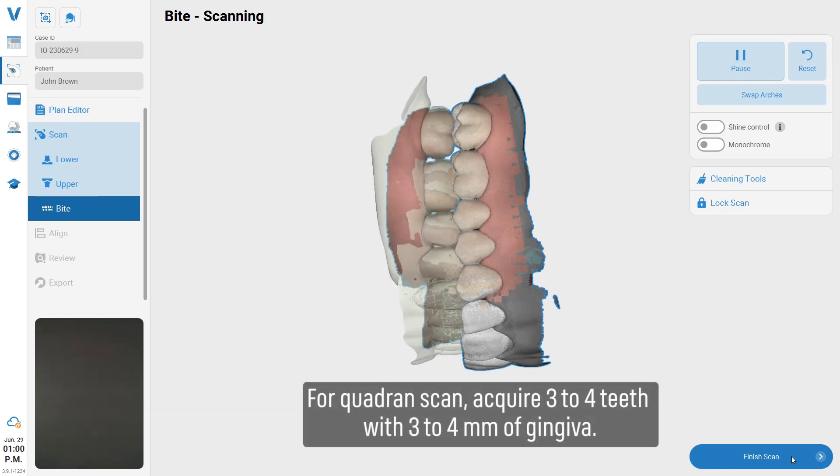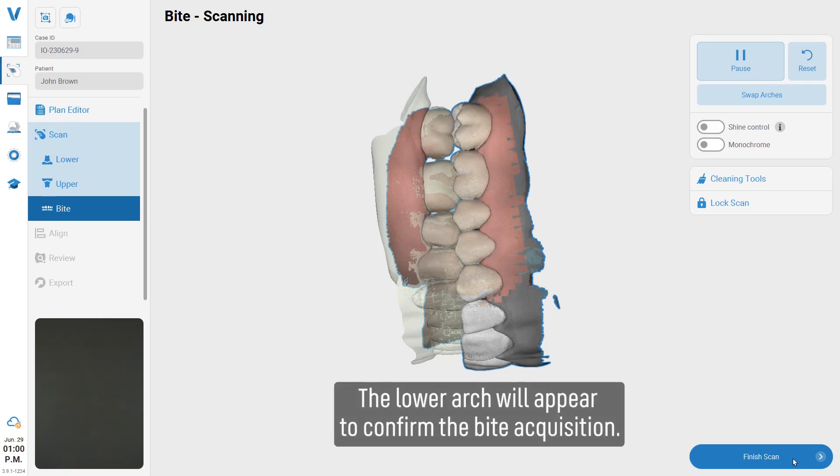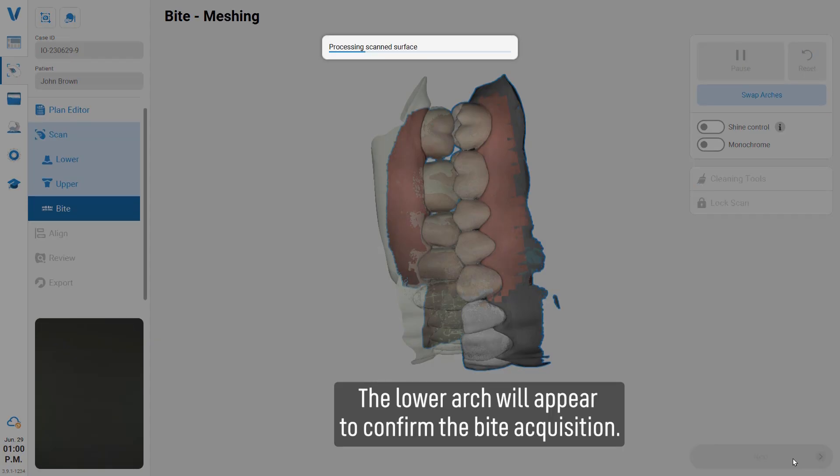For a quadrant scan, acquire three to four teeth with three to four millimeters of gingiva. The lower arch will appear to confirm the bite acquisition.